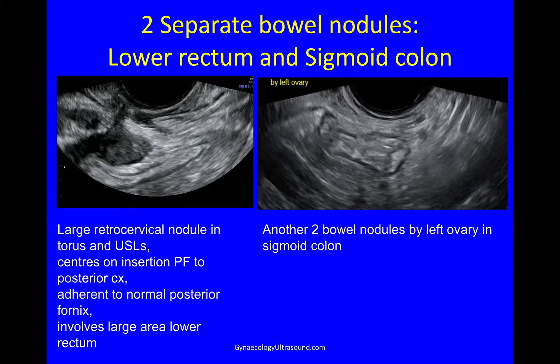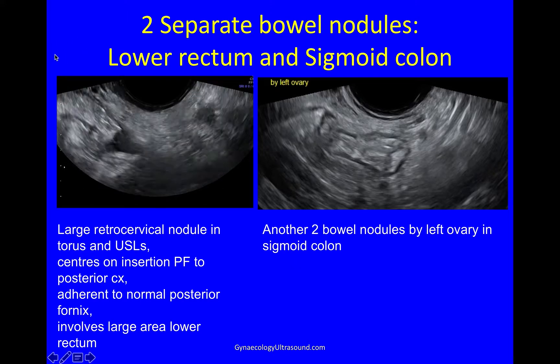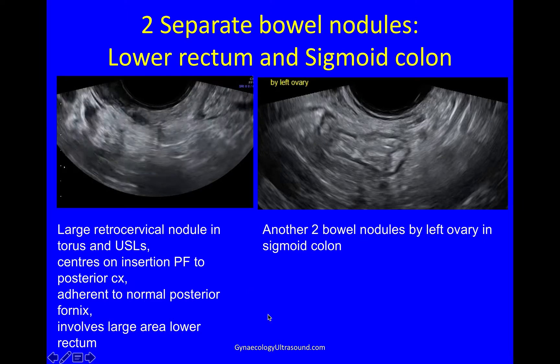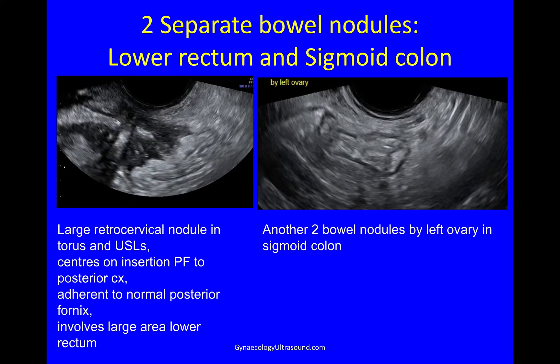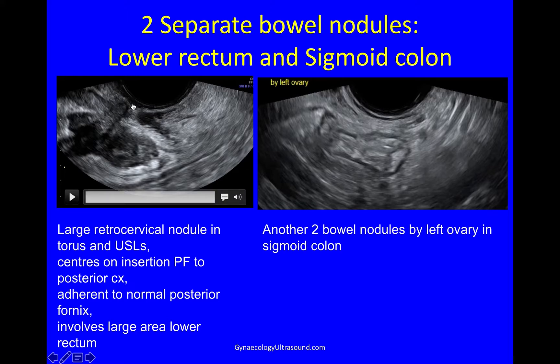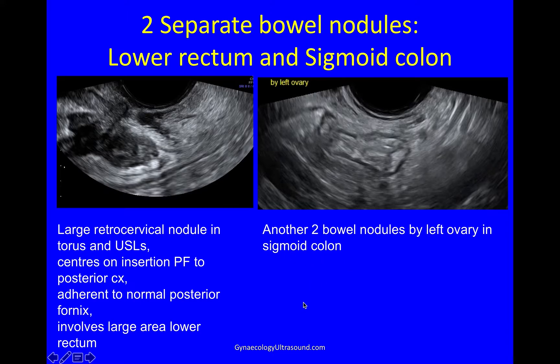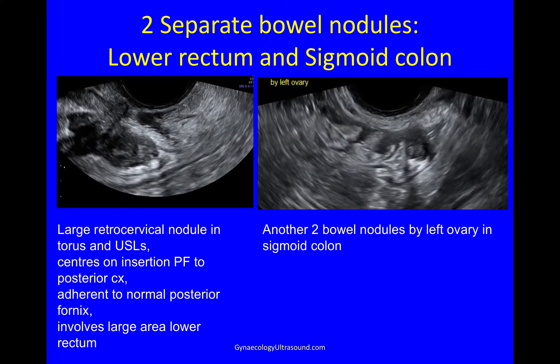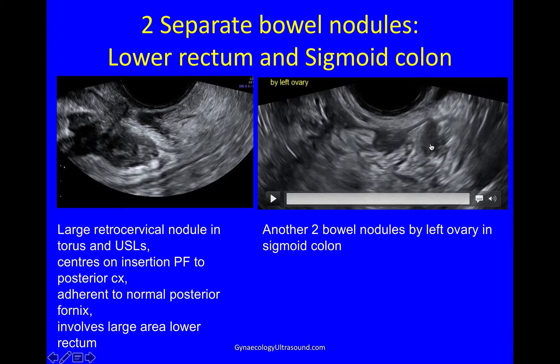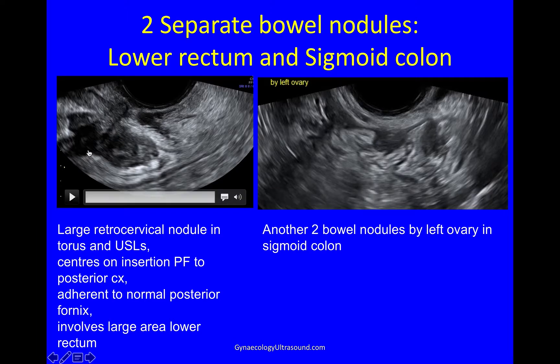Sometimes you see separate bowel nodules. In this example we've got nodules in the lower rectum and in the sigmoid colon. Here we are in the posterior fornix — the cervix is up there somewhere. Sweeping from side to side, there's a very large bowel nodule in the lower rectum in the anterior wall. It's a nodule attached to the torus and the utero-sacral ligaments, and it centres on the insertion of the posterior fornix to the back of the cervix. Looking a little bit further near the left ovary, there are two nodules in the sigmoid colon — one and two, with some normal muscularis in between. So two nodules in the sigmoid colon and one very large retrocervical lower rectal nodule.